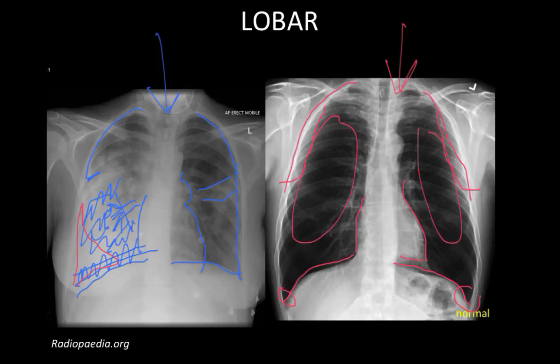The answer is a chest x-ray can't tell you if there is an infiltrate alone or an infiltrate and an effusion unless you see something called the meniscus sign, a really clean, sharp fluid layering level. It's not visible most of the time, so you don't really know if this area is just consolidation or if there is an effusion in addition to the consolidation, not by chest x-ray.